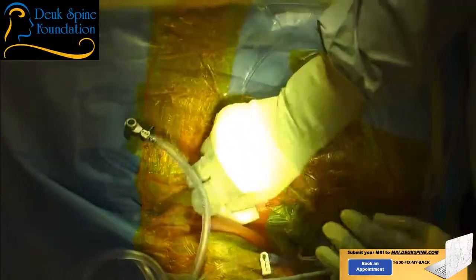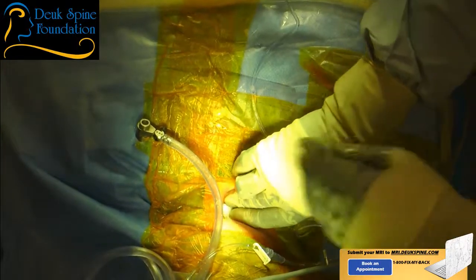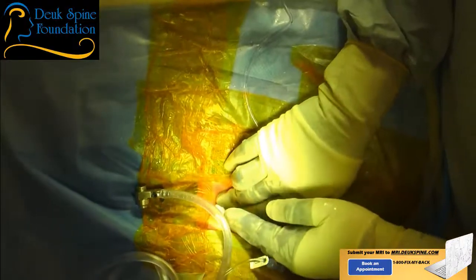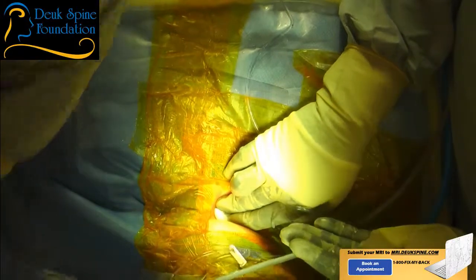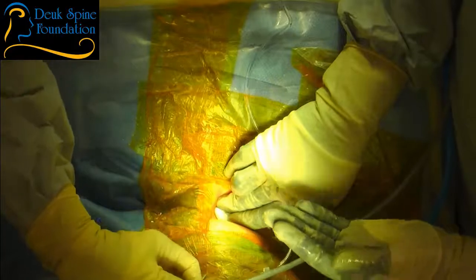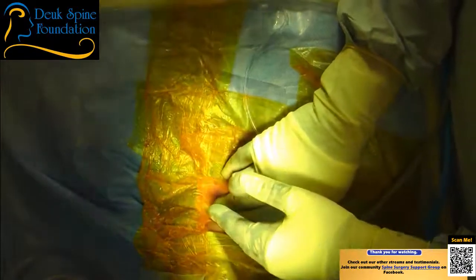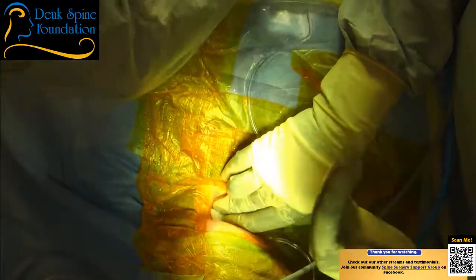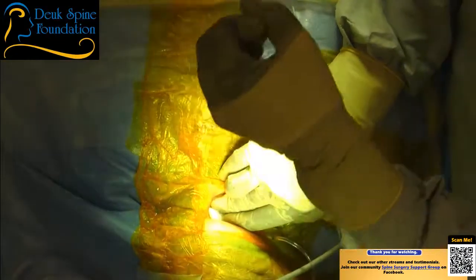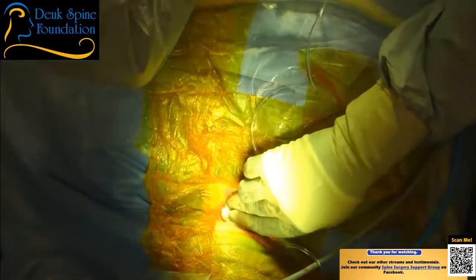I'm not worried about arterial bleeding. I mean, it could happen, but I'm more worried about venous bleeding. Now, one of the nice things for surgeons to think about here, look at this, the incision, right? It's 4 millimeters. So when you have a post-op hematoma that is in the soft tissues, it's always going to be in the surgical field. That's the tissues you've opened up to see the spine. But because we've only opened up 4 millimeters, there won't be a hematoma, even if there was bleeding. You understand? Because the only place to fill with blood is that track from the skin down to the spine. And that's not going to hurt anything. A 4 millimeter blood clot won't do anything.